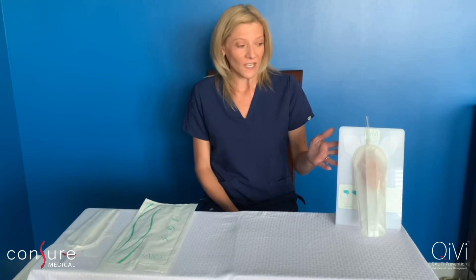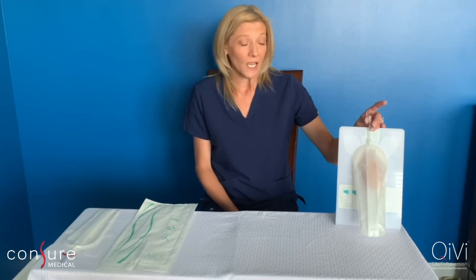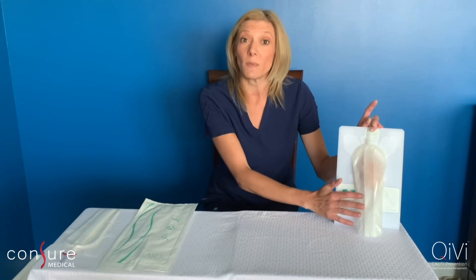QV is a male external urine management device that utilizes suction tubing and a wall canister to divert the urine away from the patient.